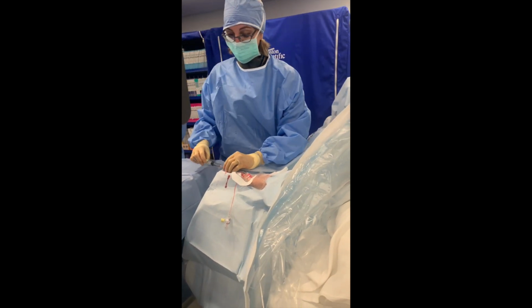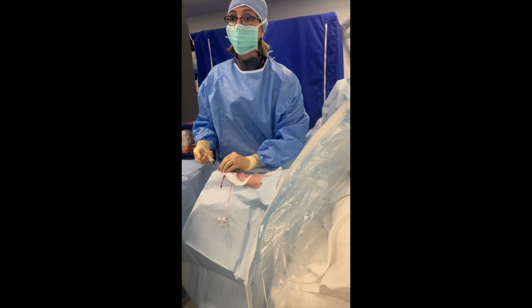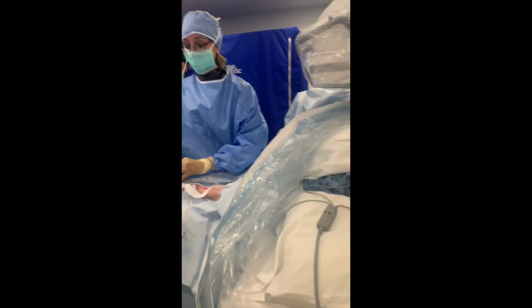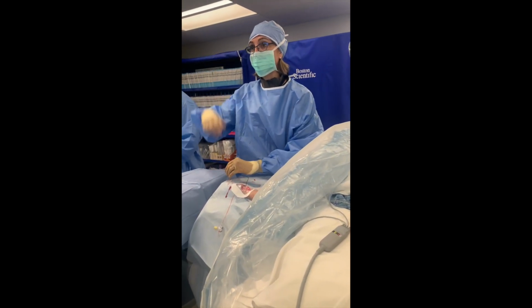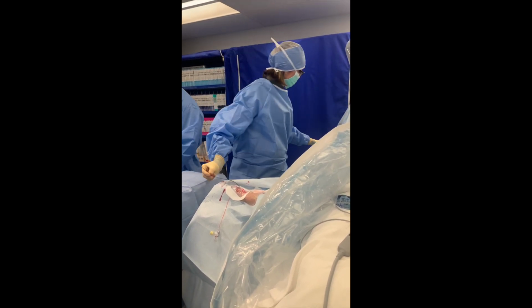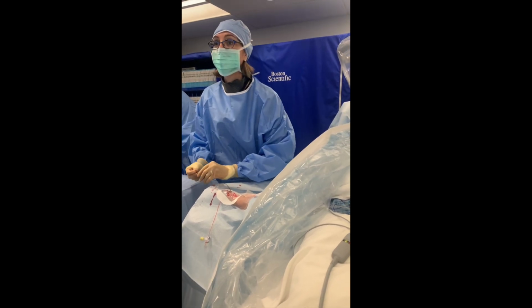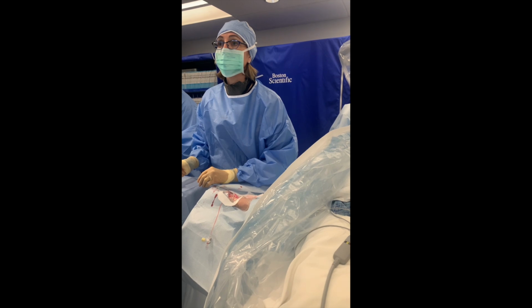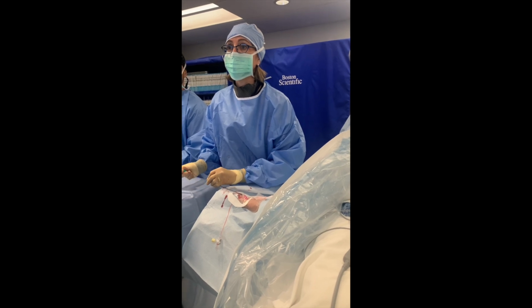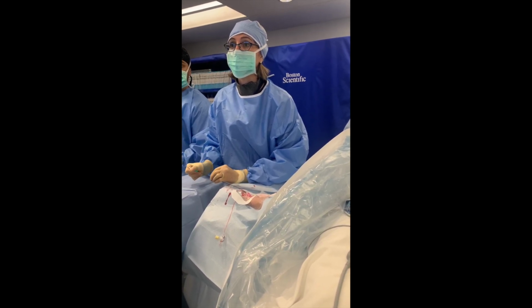Go ahead. And a little Valium beforehand never hurts, but I'm going to do a little run here because there it is. So usually you just pull back the catheter, and the catheter pops, and you can tell you're in the internal. But with people who are thin, you can spend some time trying to get into that. And with radial access, you can't have a lot of pushes back and forth, I think. You just don't get the opportunity to move the catheter quite as much.